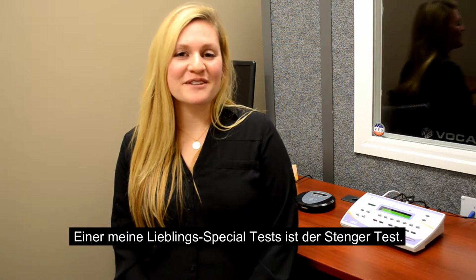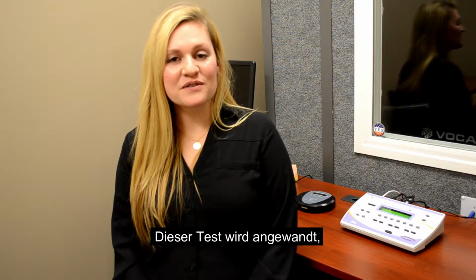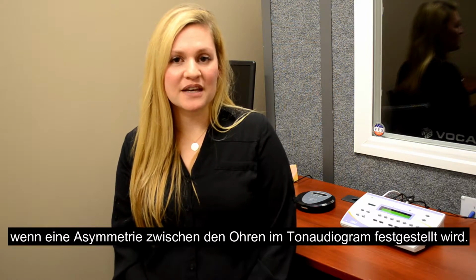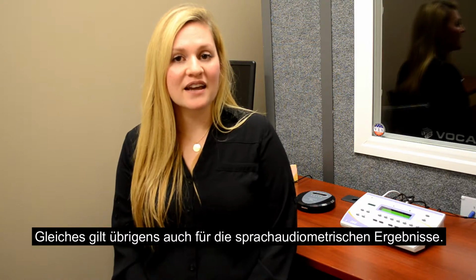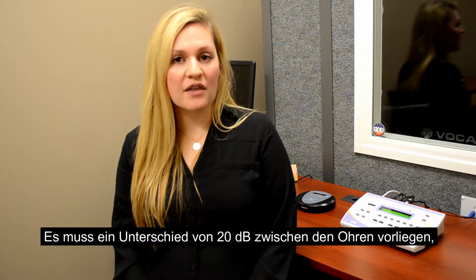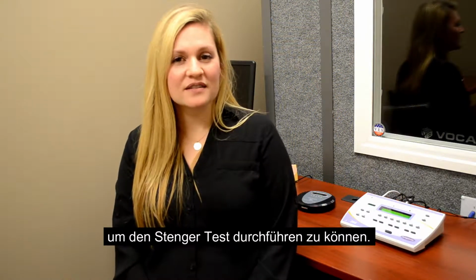One of my favorite special tests to do is the Stenger Test. This test is used if you have an asymmetry between ears in your pure tone testing or even in your speech testing. And it has to be a 20 dB gap between the right or left ear, and that's when you would be able to perform the test.